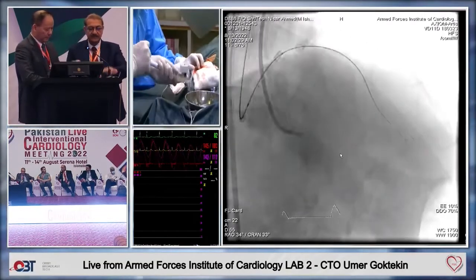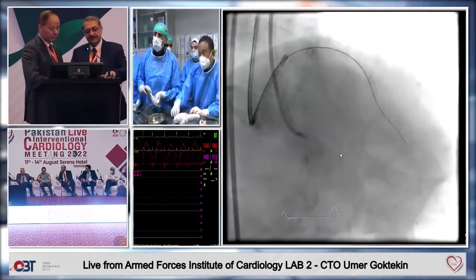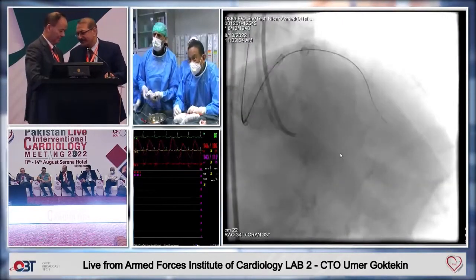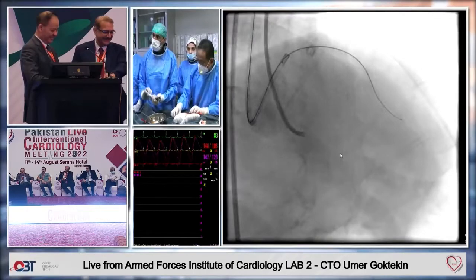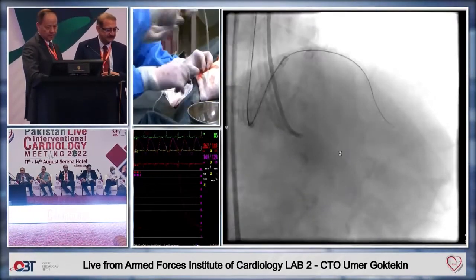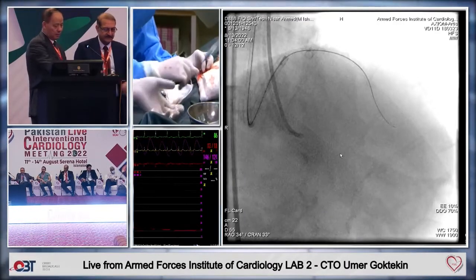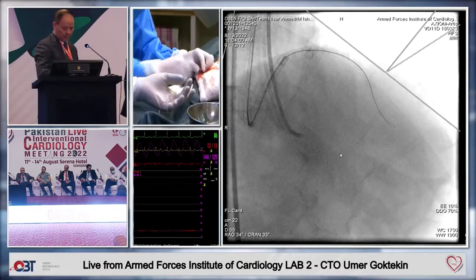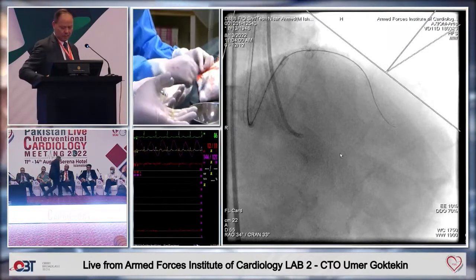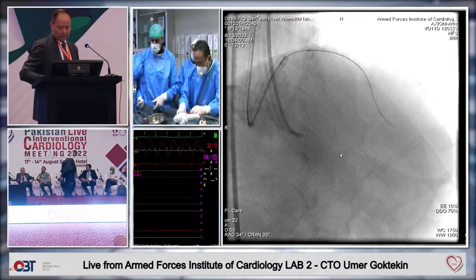Yes? Rosalie, which microcatheter did you use? This is a Fine Cross. Yeah, fine. You're going up? Stop. Actually, my choice nowadays is mainly with... No, this is the balloon. This is the microcatheter. Oh, microcatheter. Sorry. It's usually Caravel. For contralateral, I tend to use Turnpike because I find that the control is much, much better. Yeah, wire is out. Oh, okay.